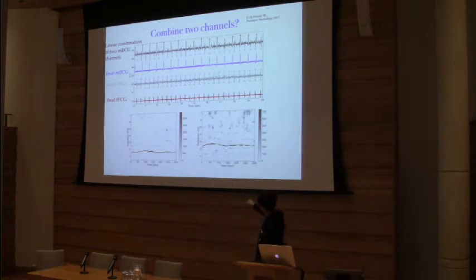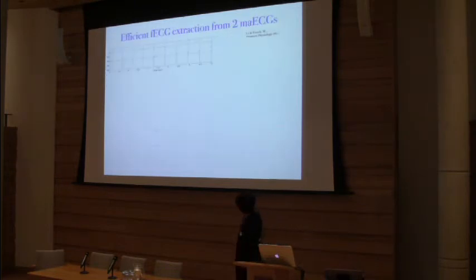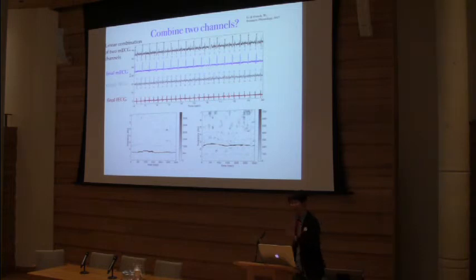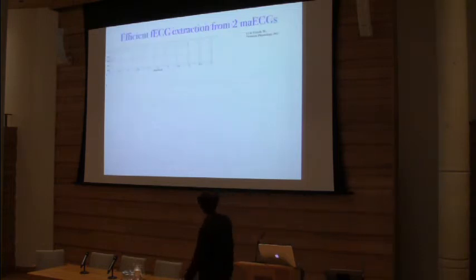And this is the time frequency representation result. Quite dominant, huh? And here you can see that the red one is the predicted R peak. The blue ones are the provided R peaks from a direct contact fetal ECG.